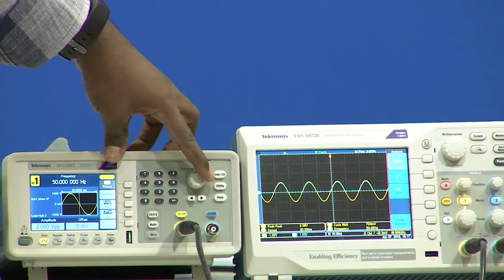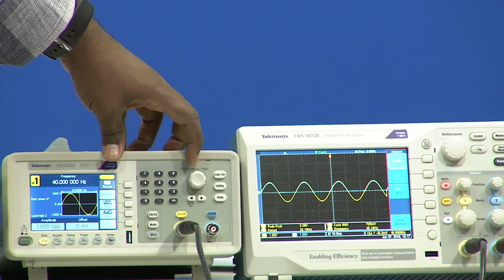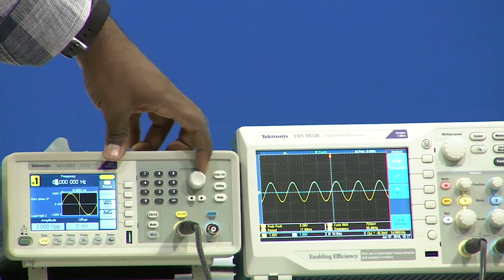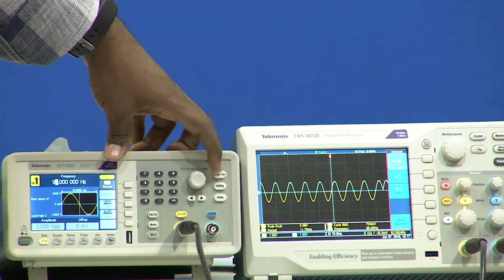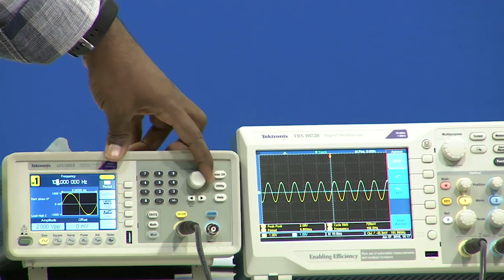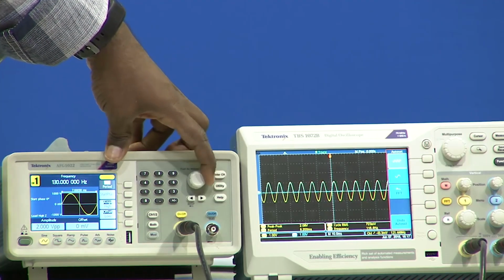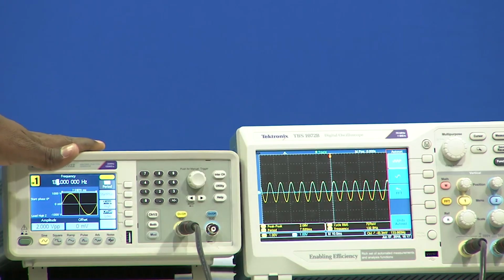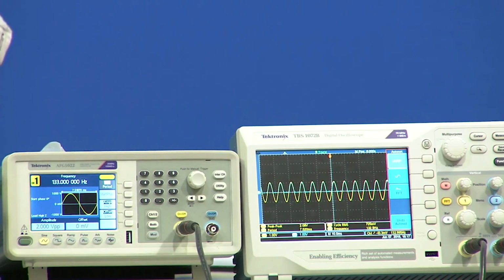Even if I change the frequencies, no matter what frequency you are at, it can only pass the positive input signal, not the negative input signal, right. So that means whatever we have seen in the simulation and what we are seeing in our experiment, the half-wave rectification is completely done. Now, what is the next part that we have to see? After passing through the half-wave rectifier, we have to find out the peak.